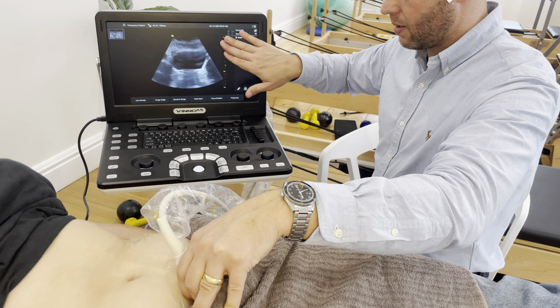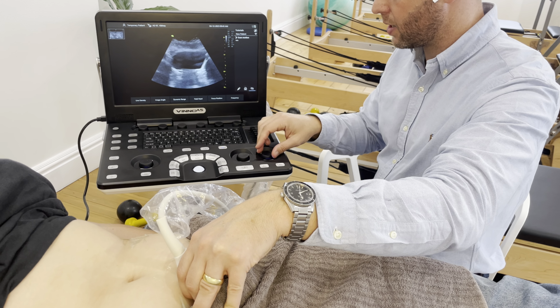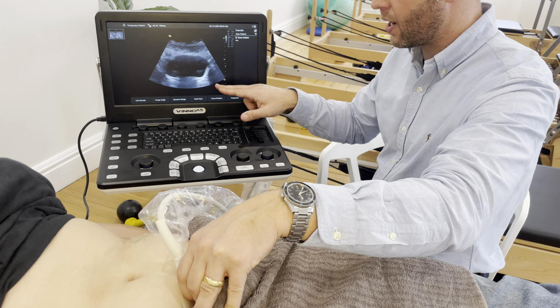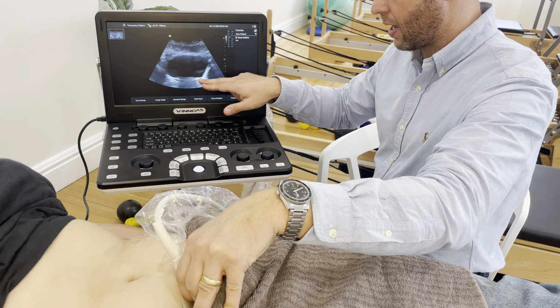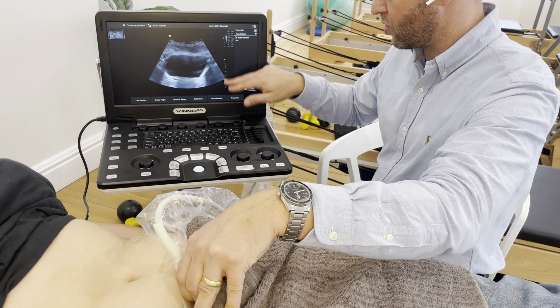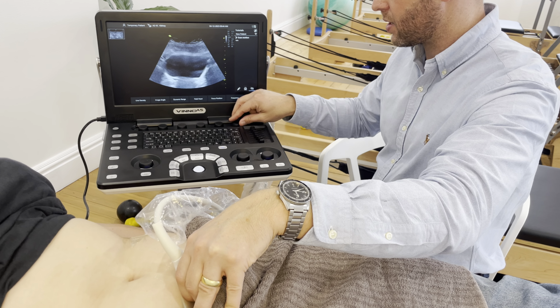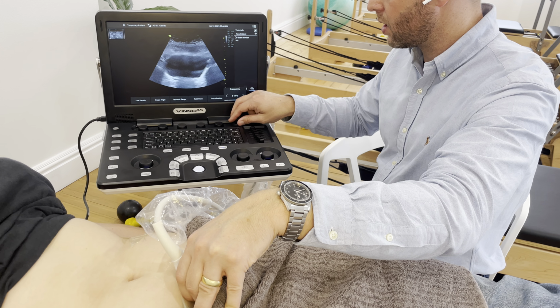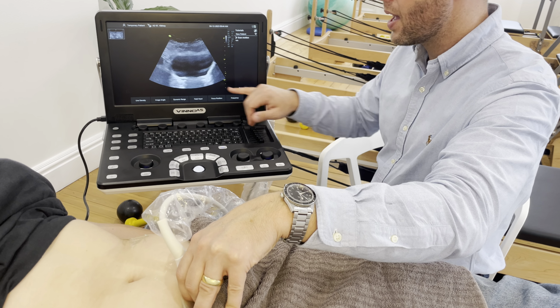If I want to adjust the image, same thing as before, I always start by making the depth appropriate. So I want to be able to see movement. I want to be able to see this quite large. In terms of the focus position, I want that to be down somewhere near the base of the bladder here. So I'm going to drop that a little bit from where it was down to here. And I might just increase the frequency as well, and just see if that gives me a clearer image. So the second highest frequency I think was best for us.